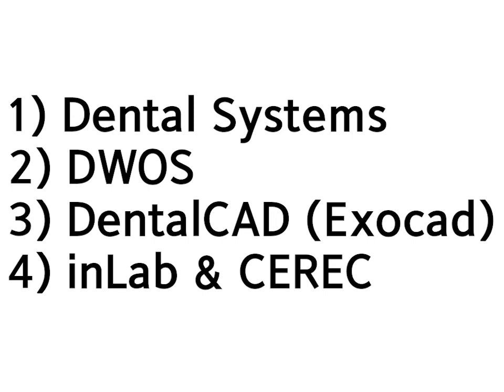Moreover, with add-on modules, it is possible to make more complex work. The acquisition of these additional modules is flexible and can be done according to the needs of the lab technician without the need to acquire all of them. More recently, exocad has developed a simplified version of the software for use in the dental office that can be used to prepare restorations chairside with different milling units.